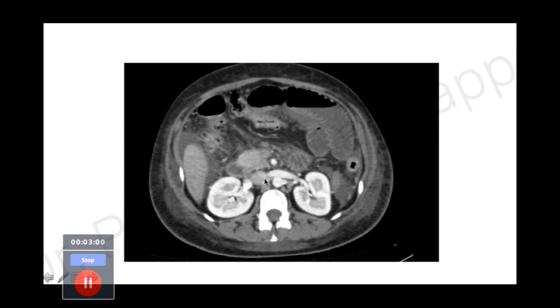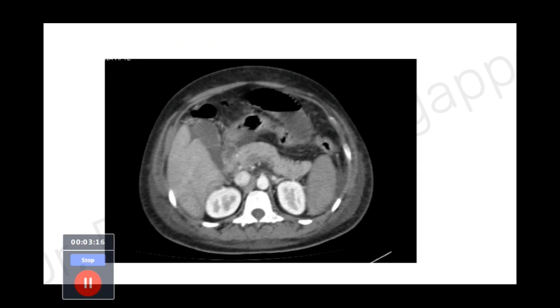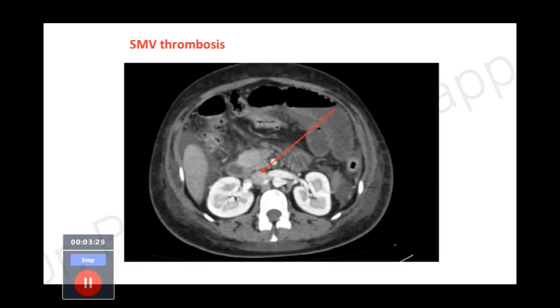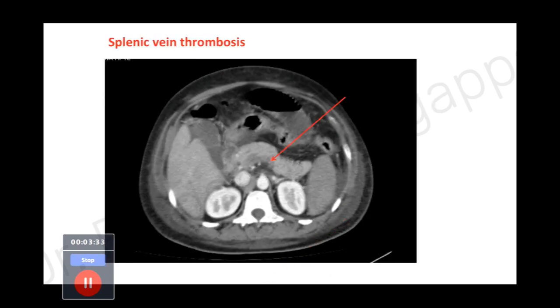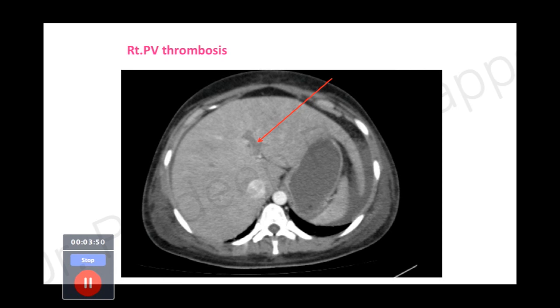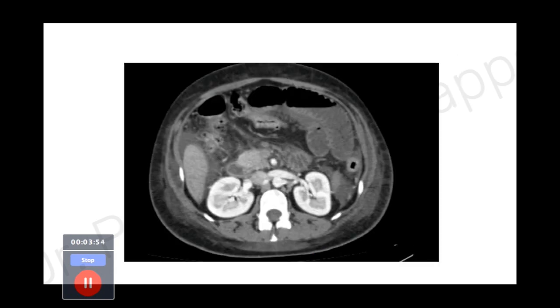On the contrast CT, a thrombus is also visible in the superior mesenteric vein. So this patient had ischemic bowel with SMV thrombosis and right portal vein thrombosis. Additionally, near the pancreas, there is a splenic vein thrombosis. I must confess none of us here are radiologists, but we discussed the scans with our radiology team. To summarize: right portal vein thrombosis, superior mesenteric vein thrombosis, and splenic vein thrombosis.